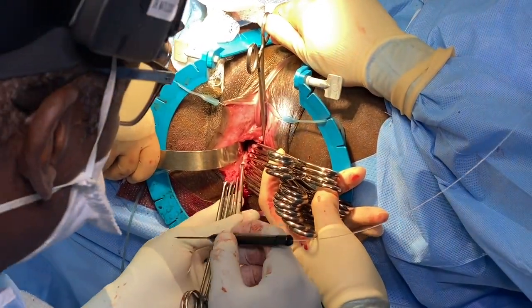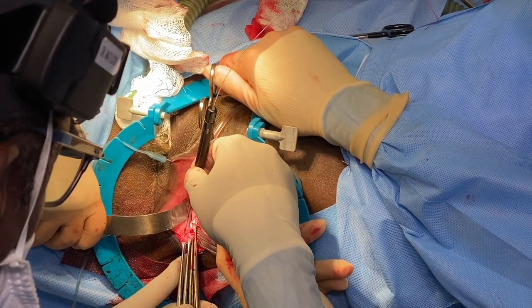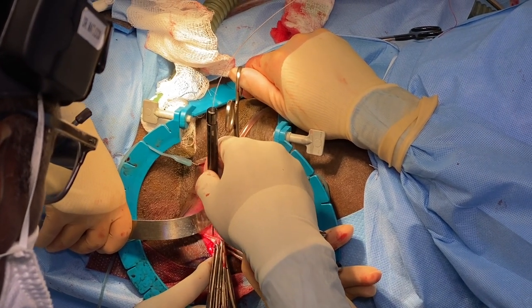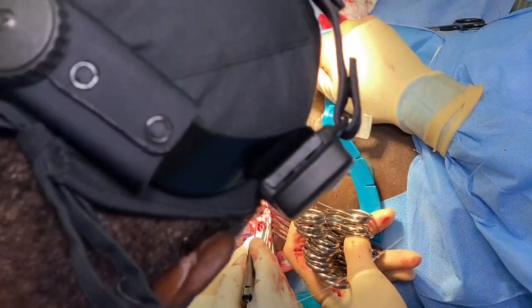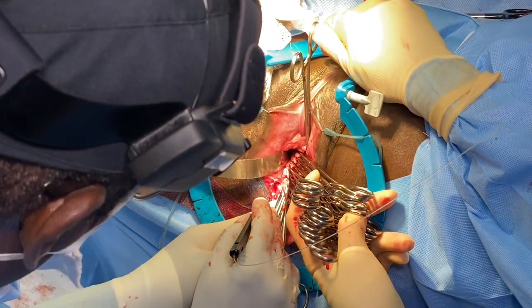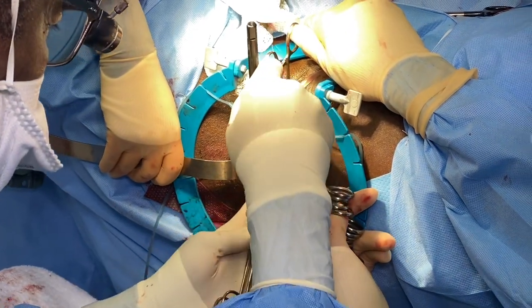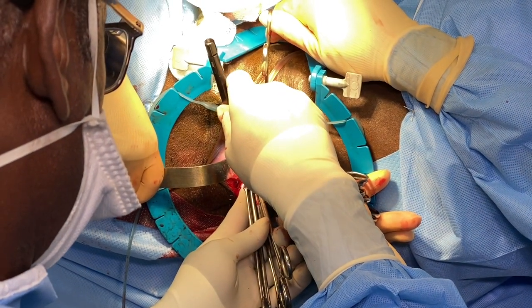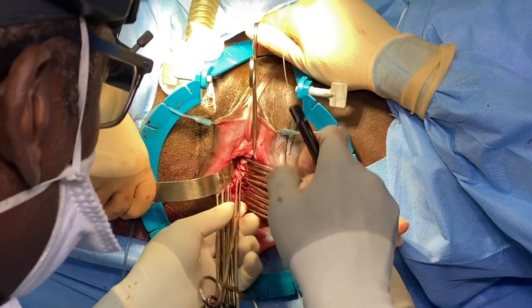We'll bring you back in. Now I'm going to resect the excess mucosa. I'm determining the exact amount to take off. What I take off on the right, I will take off on the left. I will go all the way up to the apex. That's my incision in the midline. And then we'll go to the other side.